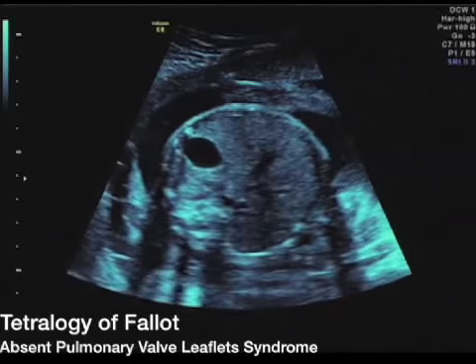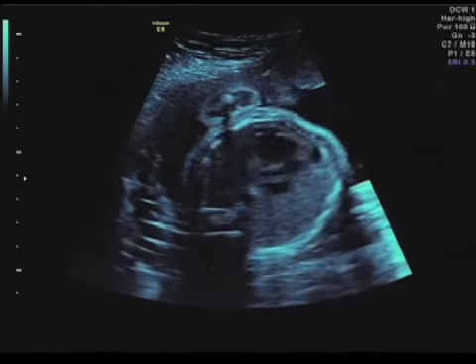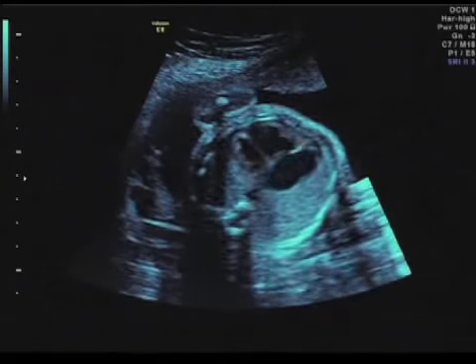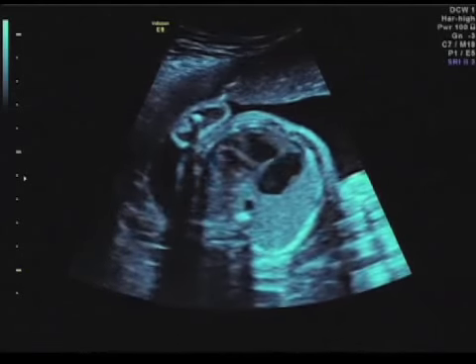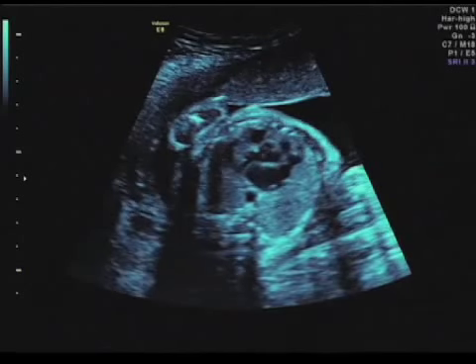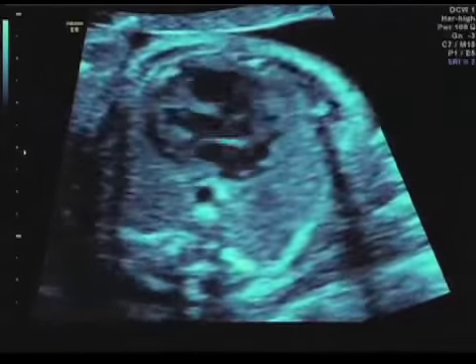This is another case of tetralogy of Fallot. In this particular case, the heart is relatively big, especially the right heart structures. Note the right ventricle, quite a bit larger than the left. Here we have the overriding of the aorta, nicely seen.